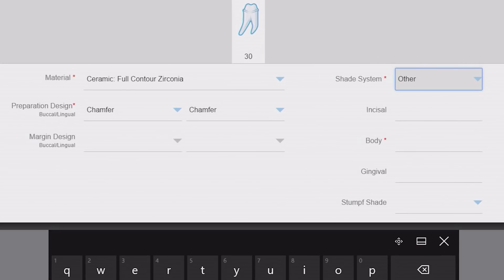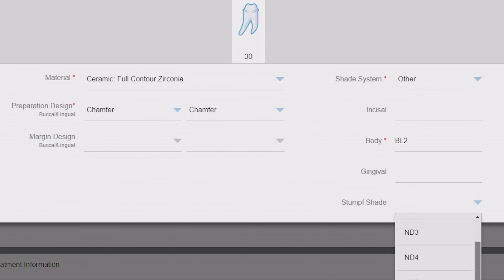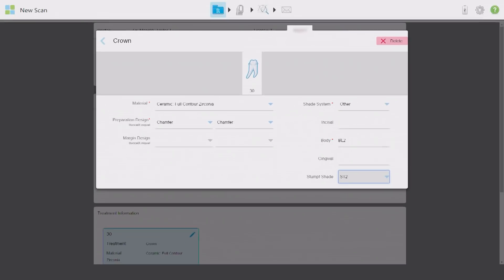If any shade information has already been entered, changing the shade system will remove the existing entries from the RX. For instance, I can select Other and manually enter a BL2 body shade, and even incisal and gingival shades if necessary. Don't forget to take and enter the stump shade, especially for restorations that aren't fused to metal copings. There is never such a thing as providing too much information.